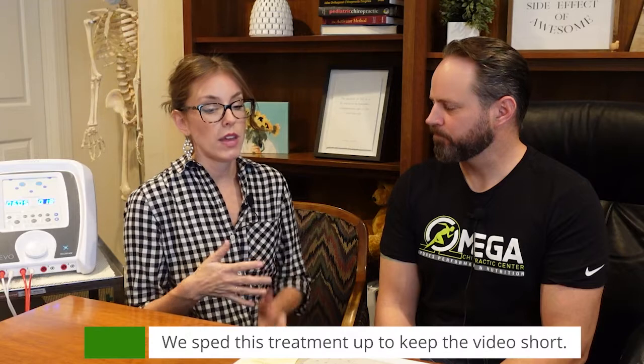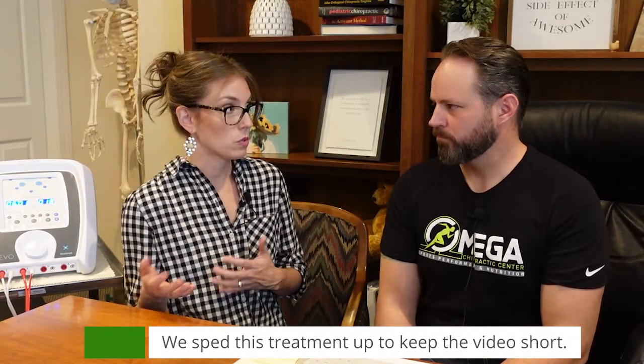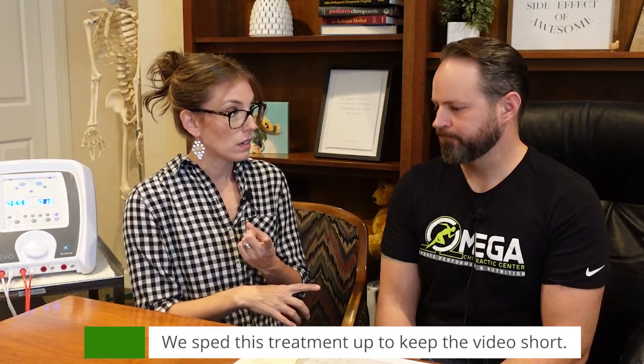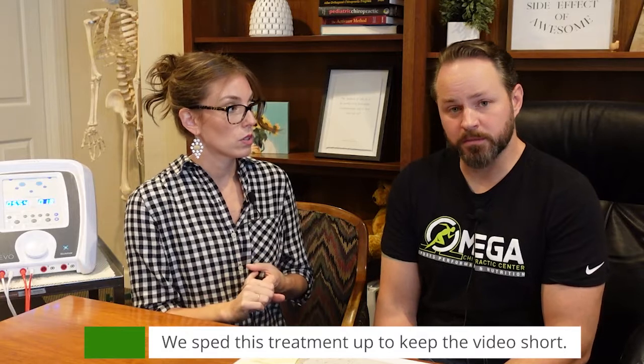So the typical time that we would keep a patient on muscle stim would be about 10 minutes, right? 10, 15. Yep. And the reason that we would want to recommend that for patients would be because of pain, to decrease inflammation, and also decrease spasm. So if you have an area that's very tight, sometimes if it's so stiff in there, I like to have this done before I adjust, or before they go back and exercise. That's for the stiffness part.